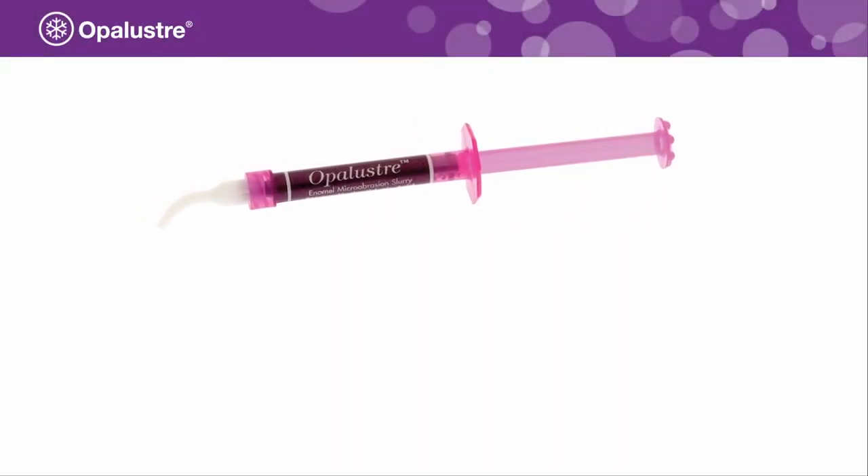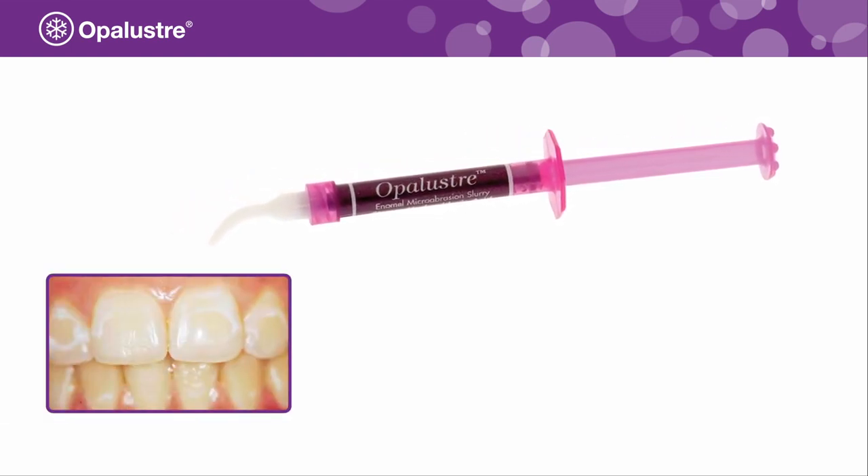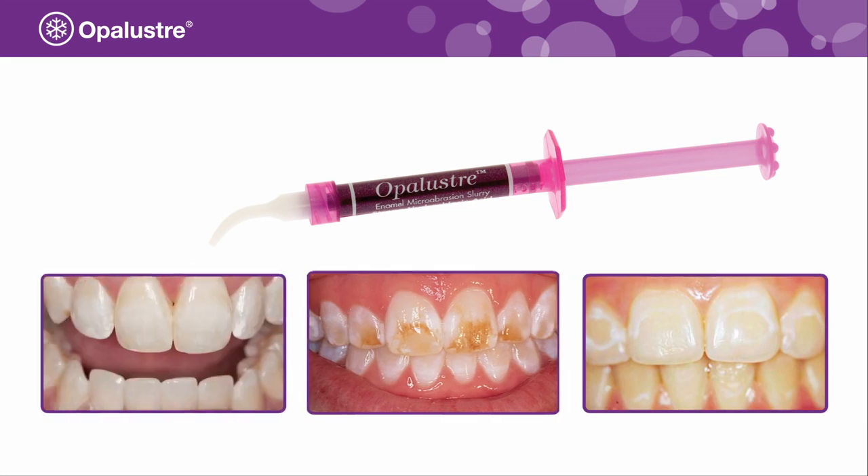Opal Luster is a chemical and mechanical abrasion slurry used for the correction of superficial white, brown, or multicolored enamel defects, including fluorosis discoloration.